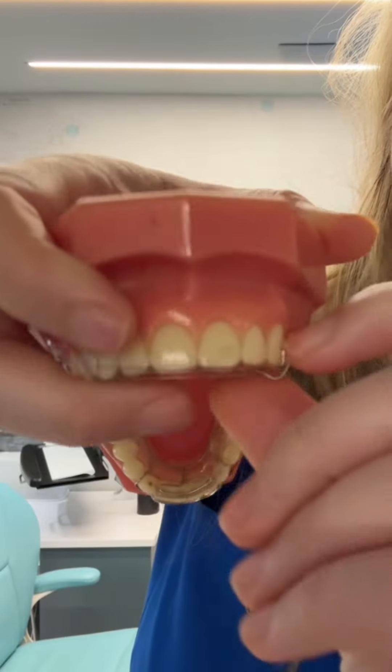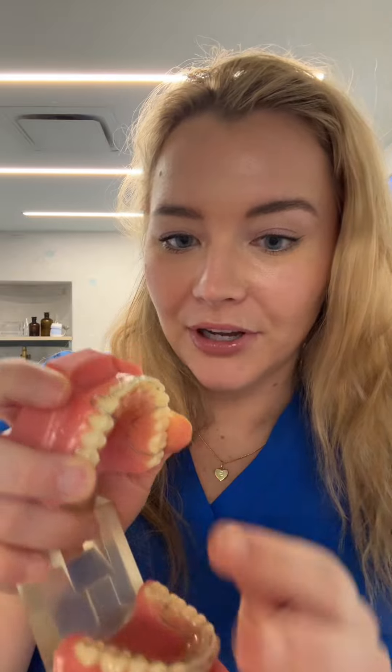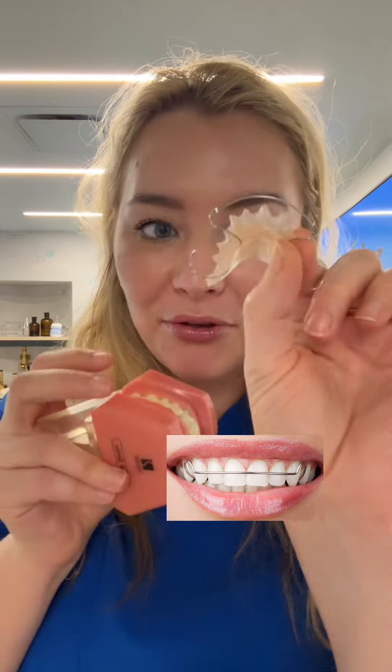Number three is they do get loose. If you pull the retainer off by the hook here, it can cause this to loosen over time, which means you'll have to go into your orthodontist more often to get it corrected. So if you grind your teeth or you have a tooth you're worried is going to shift after braces, you want to get the clear retainers — you don't want to get the Hawley retainers. It's also not as fun to walk around with a wire on the front of your teeth.